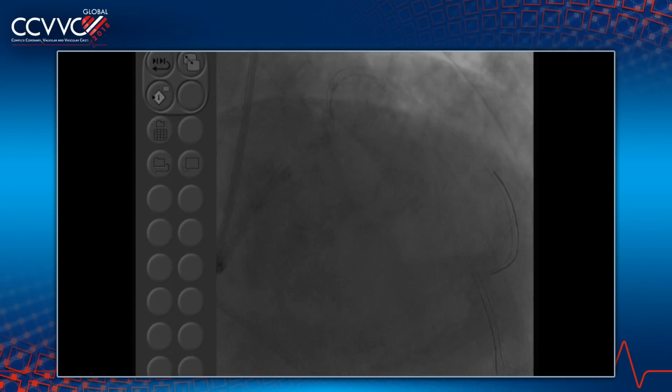Going back to the bifurcation technique, the wire in the circumflex, right? They have the wire in the circ. Now going back to the bifurcation technique, I think Samit can show side by side the Bifurcate app. Yeah. So the question is, what is the technique that we are going to go with? I think also for the trainees in the audience, it's a nice app to be shown.